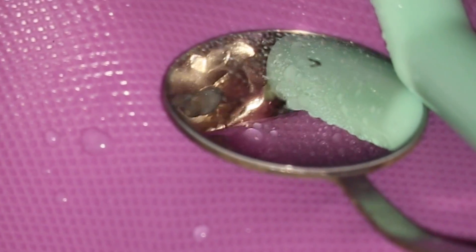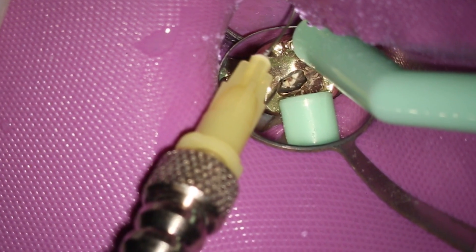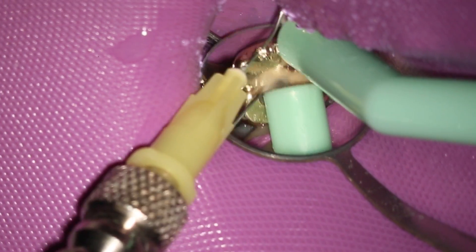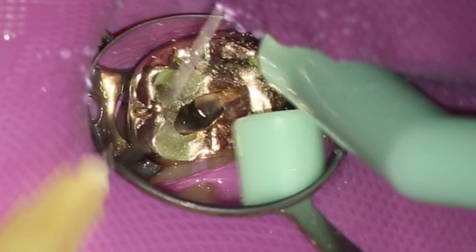And then we're ready to irrigate out the calcium hydroxide. I use the mini air and water stropco. And usually by this time, I'm able to get that needle very close to the apex. And you can see the calcium hydroxide just coming out.